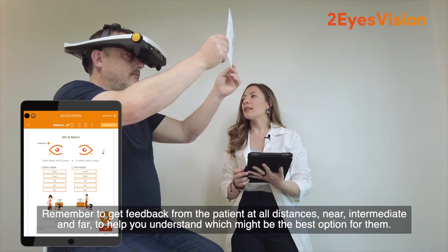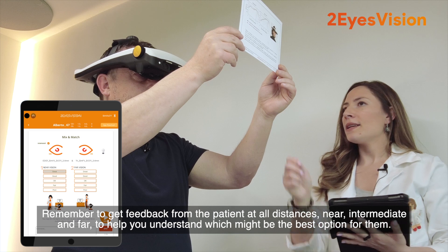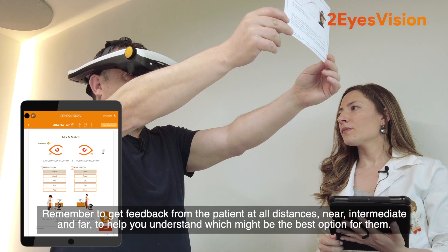Remember to get feedback from the patient at all distances — near, intermediate, and far — to help you understand which might be the best option for them.